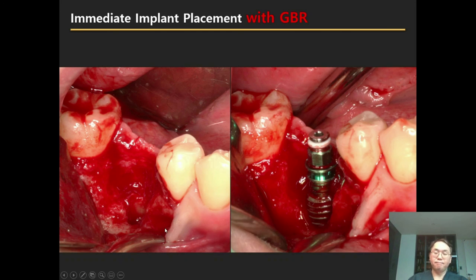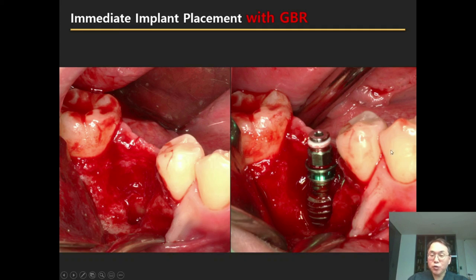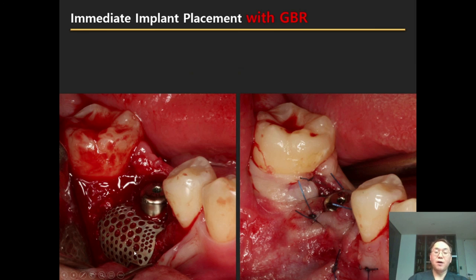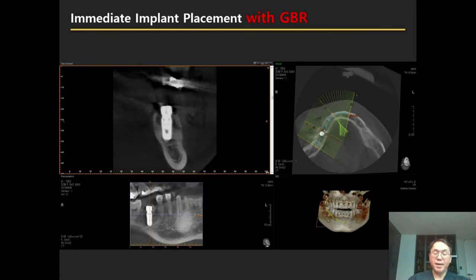In this case at the lower right first molar (post-6), there was a pre-existing buccal bone defect — a Type 2 socket. After extraction, I opened a flap and placed the implant. To maintain buccal bone thickness greater than 1.5–2.0 mm around the implant, I used Smart Builder and a sandwich bone augmentation technique: allogenic bone graft material was placed to cover the exposed implant, then non-resorbable xenogenic bone on the outside to make thick buccal bone. Smart Builder was placed to cover the entire graft material and fixed with a healing cap, and primary closure around the healing abutment was done. The CBCT shows Smart Builder contouring the ideal shape of alveolar bone.